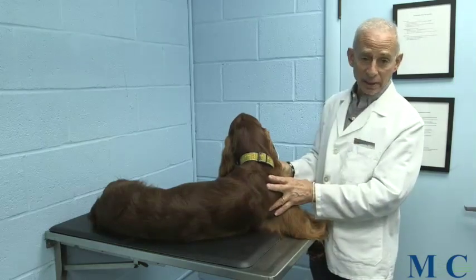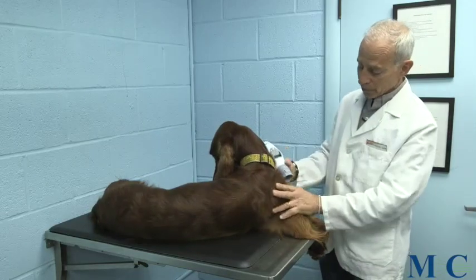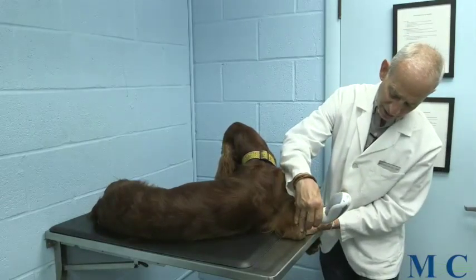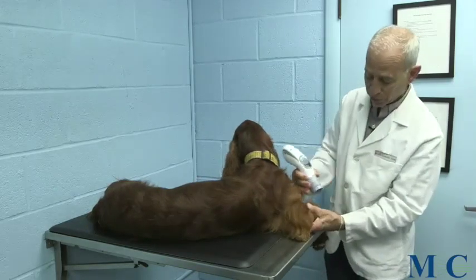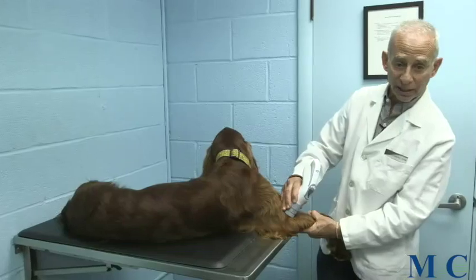If we move down to the elbow, same regional lymph nodes — prescapular and axillary. For the elbow itself, we're going to do probably a single placement on the outside of the elbow and a single placement on the inside. If you suspect there's a problem further forward or anterior in the elbow, we may straighten the leg out and find a nice notch where we can fit the unit in as well.